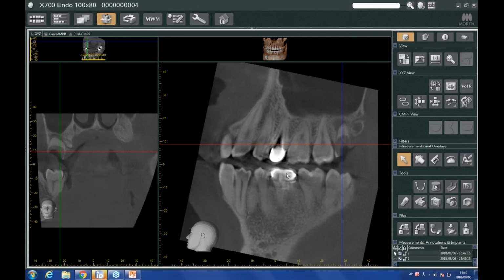parallax. Now, for those of you who haven't heard the term parallax, imagine very basically cutting a carrot. If you cut a carrot directly in half and you look at that carrot, it's going to look like a nice round circle. It'll have the root in the center and no distortions. It's just a nice, beautifully round circle. But if you went ahead and cut that carrot at a 45-degree angle and looked at it that way, it's not going to be a perfect circle anymore. It's going to be more of an oval.